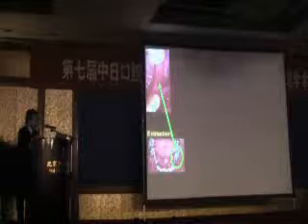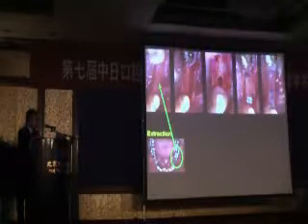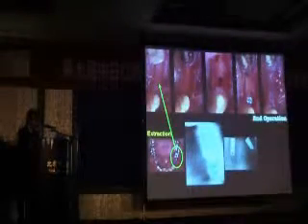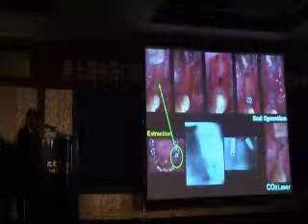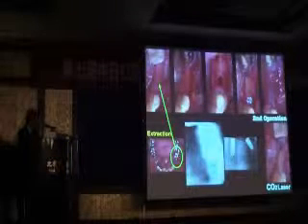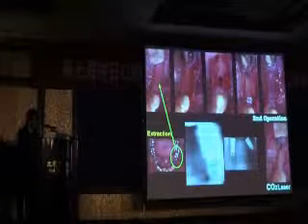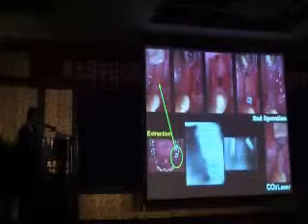I extract teeth number 4 and 8 from the lower left. I insert implants into number 4 and 6. No implant was inserted to number 5 since there were 2 mandibular canals. CO2 laser is used for the second surgery.